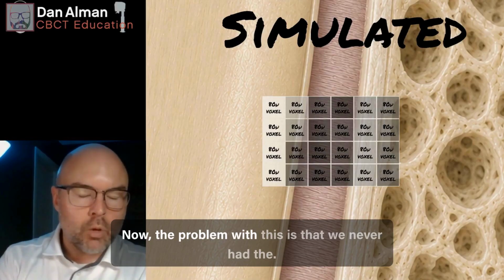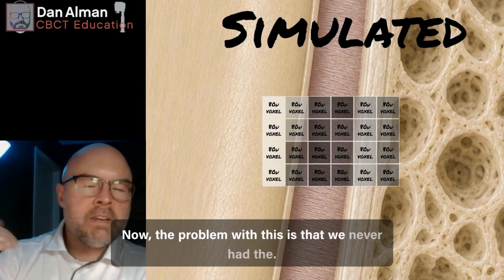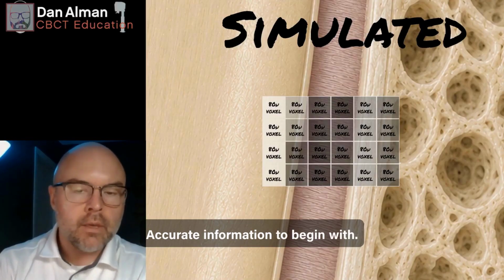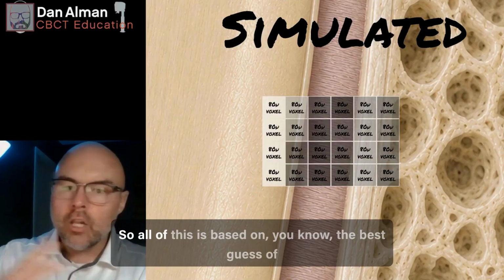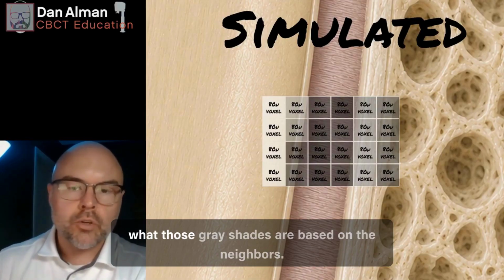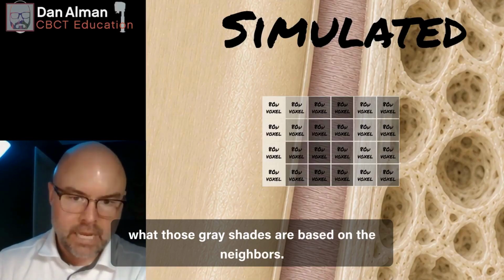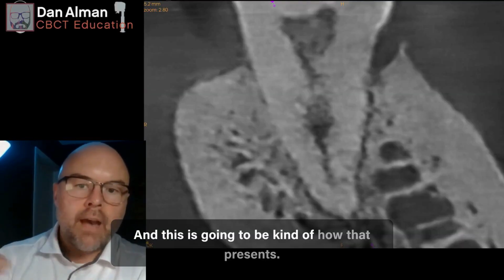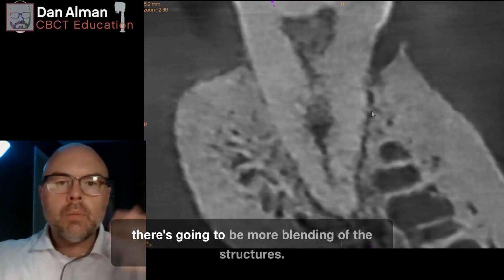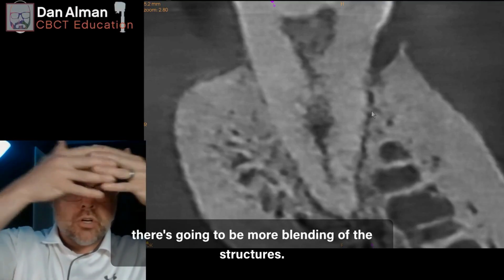Now, the problem with this is that we never had the accurate information to begin with. So, all of this is based on the best guess of what those gray shades are based on the neighbors, and this is going to be kind of how that presents. And if we're looking at that, there's going to be more blending of the structures.